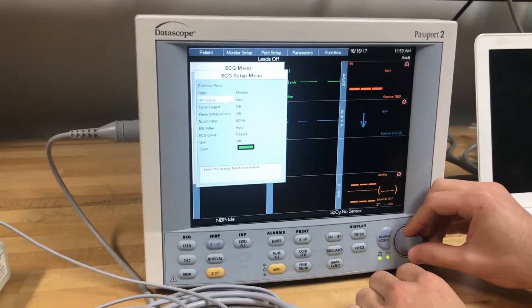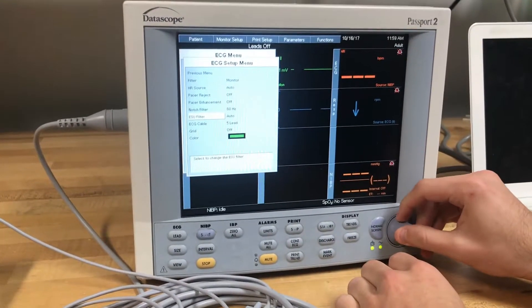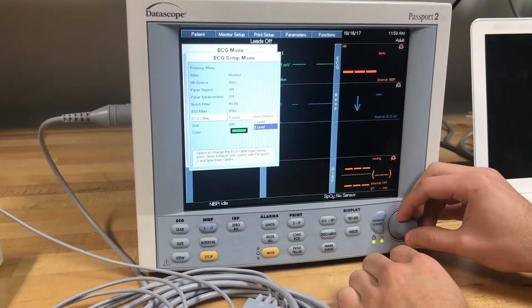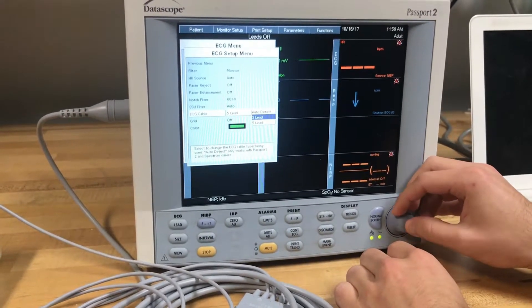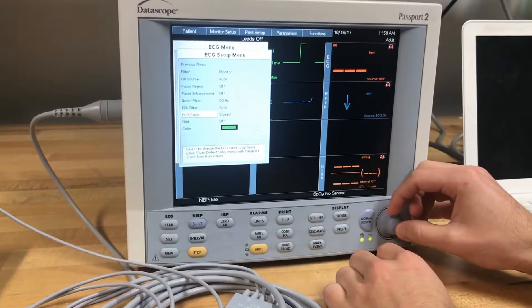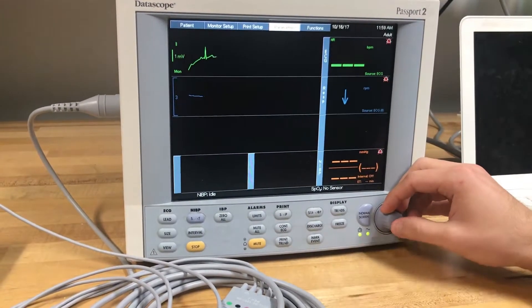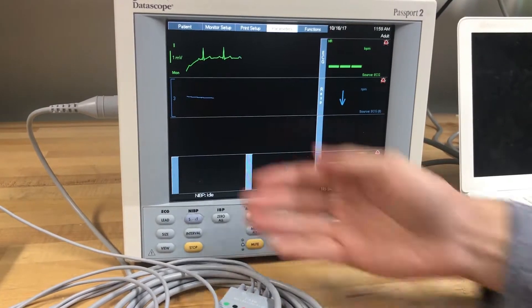Scroll down to the ECG cable and then select the number of leads that your unit has. Verify that the ECG waveform is now on the front screen.